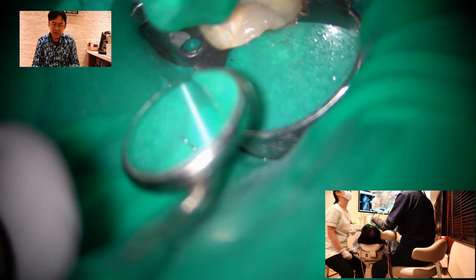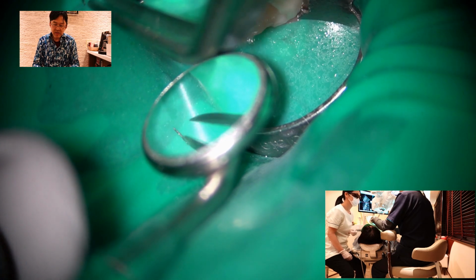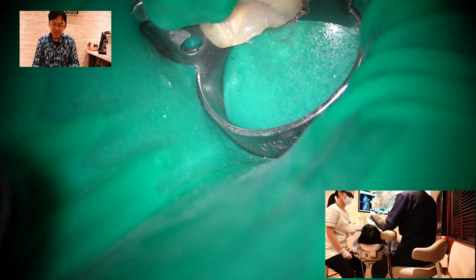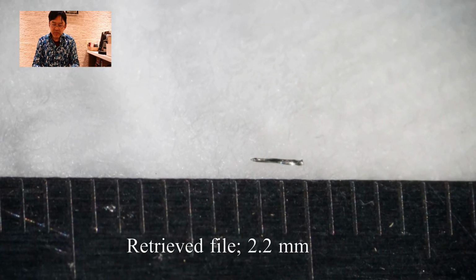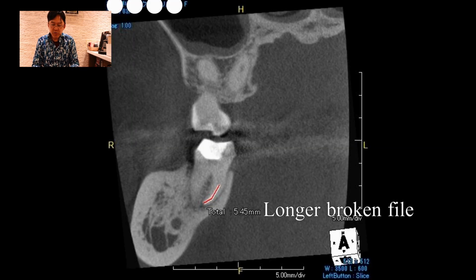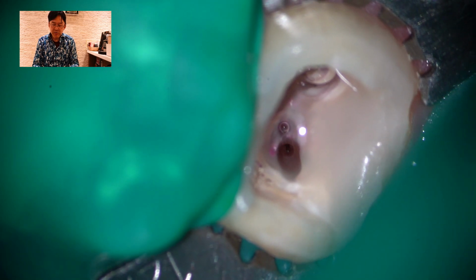So as you can see, it's on the rubber dam sheet. And I took it out. It was 2.2 millimeters. Now let's try the other broken instrument, 5.45 millimeters on the CBCT image.